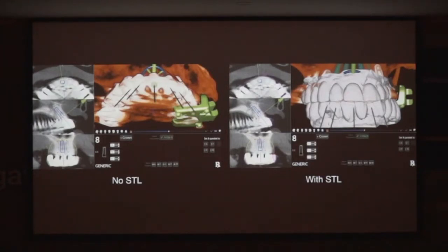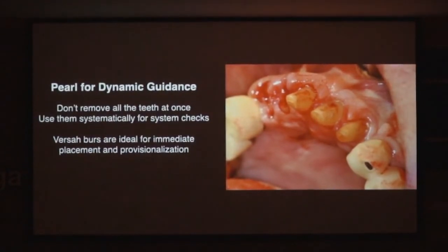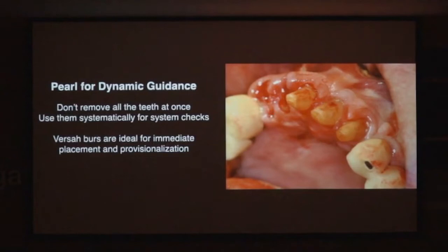It takes seconds to do it. So let's talk about bone reduction and extracting teeth when you're doing implants. Now, when you're using a static guide, and these are all coming out, you can't use a static guide with the teeth in there, can you?